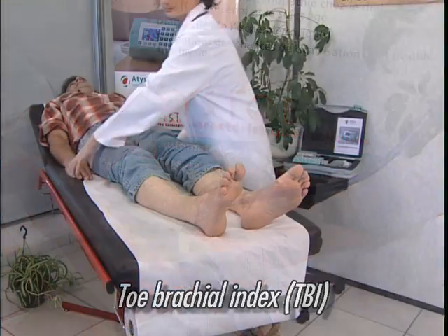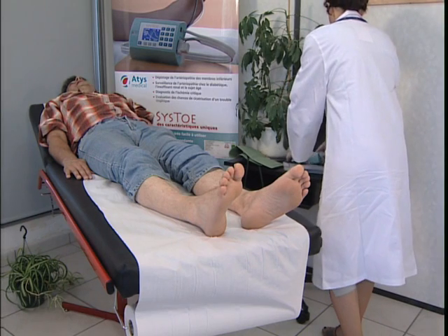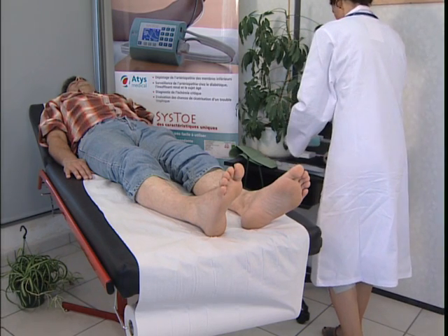Check that the patient's feet are not too cold. Take the SysToe out of its case. It is an independent unit ready for use.